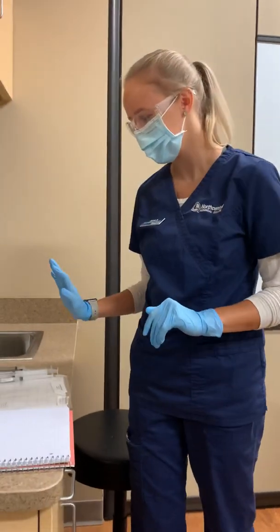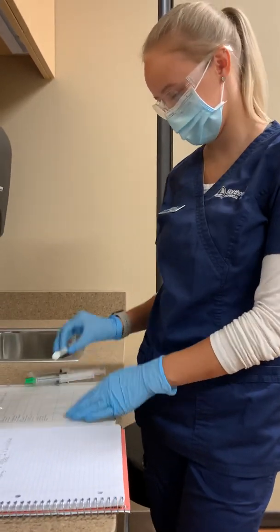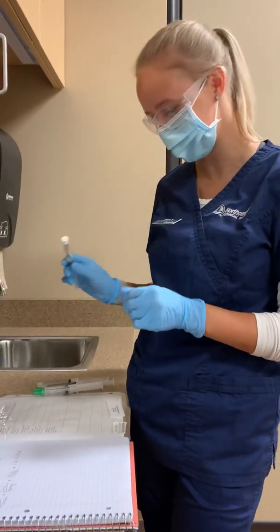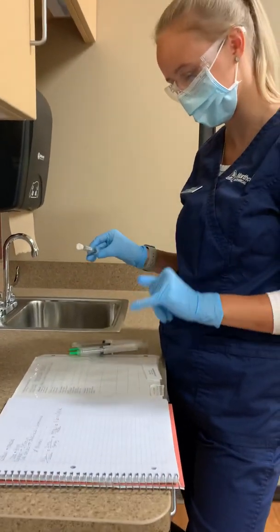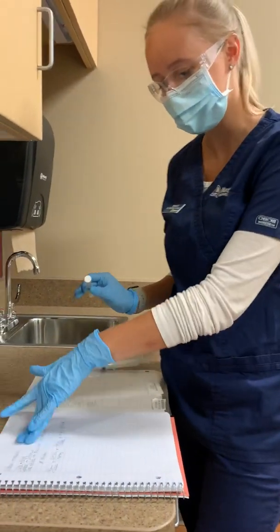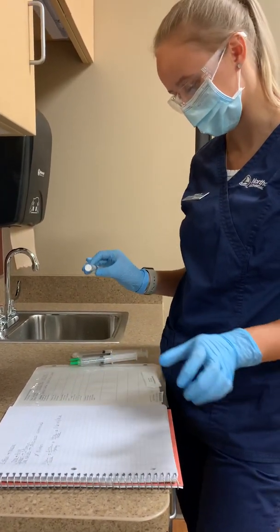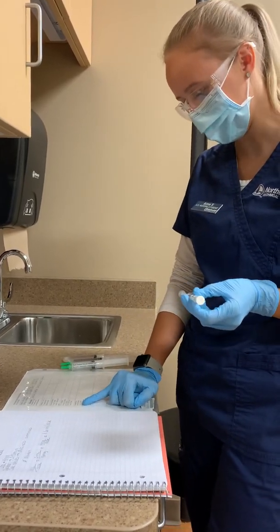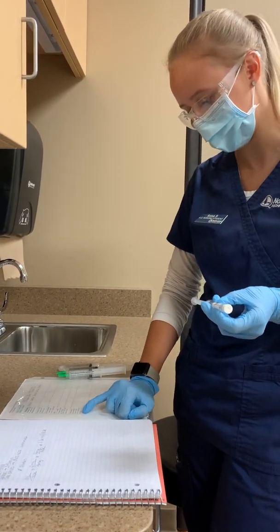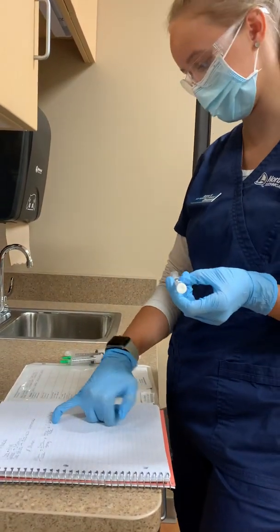Okay, so we are going to be giving Mary Smith Zofran for her nausea. Mary is allergic to morphine, which is not a Zofran, so that's not a problem. I looked up my medication already and did my dosage calculation. She's supposed to get Zofran 4 milligrams IV push every 4 hours, PRN for nausea, so she's going to get 1.6 milliliters.